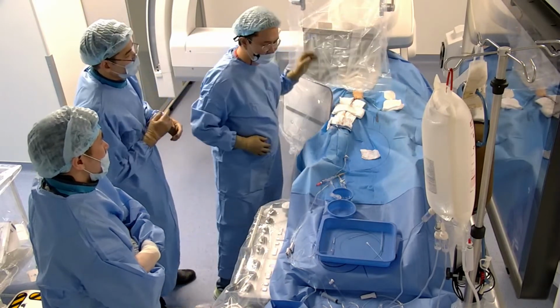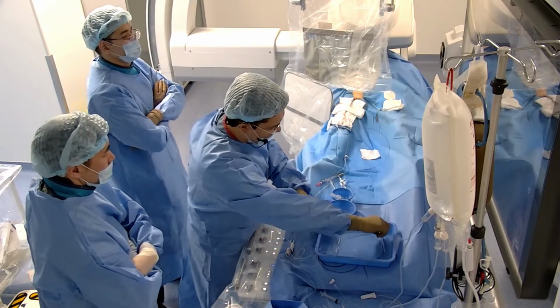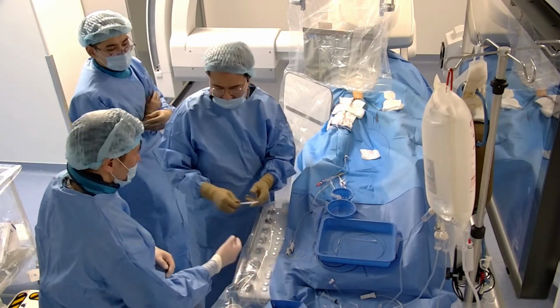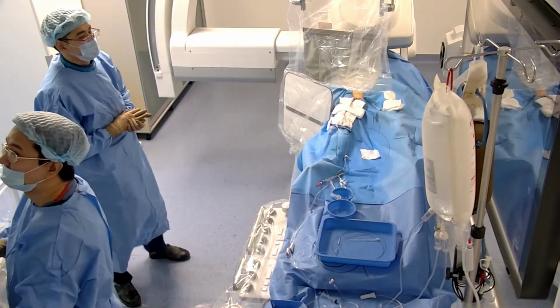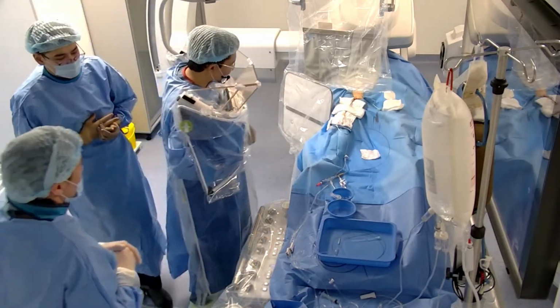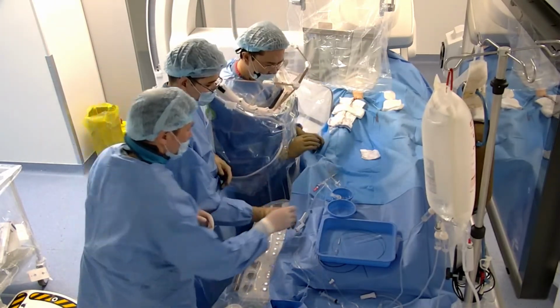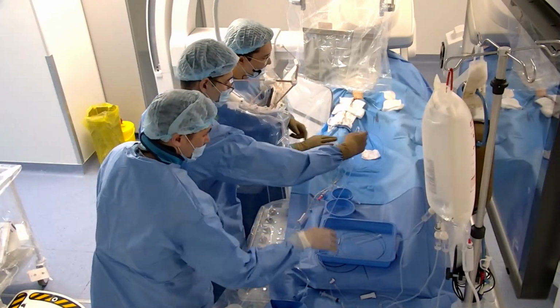Yes, we planned to do under local anesthesia, but the patient said she has a pain in the right shoulder and she couldn't lie on the table for 1 hour. And the aneurysm is quite small, that's why we decided to switch to general anesthesia. I think it's a better decision, and all for the patient.